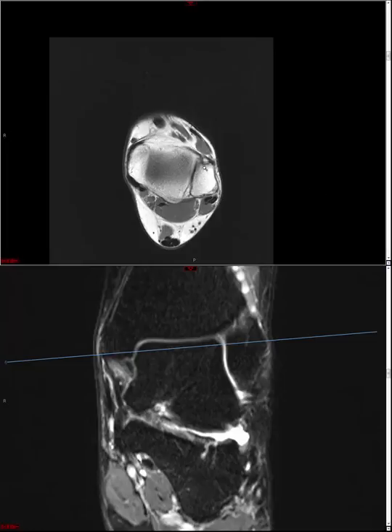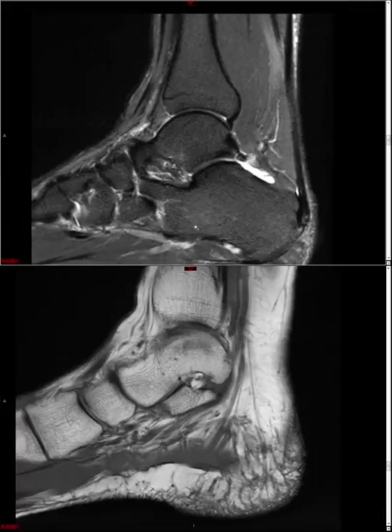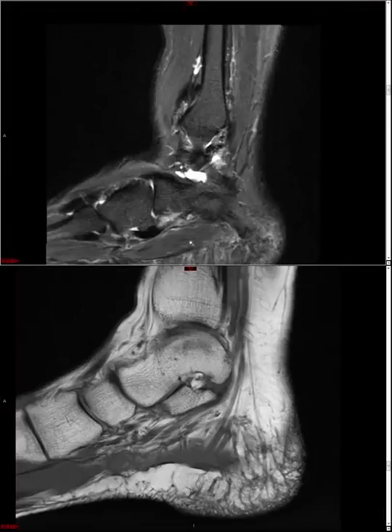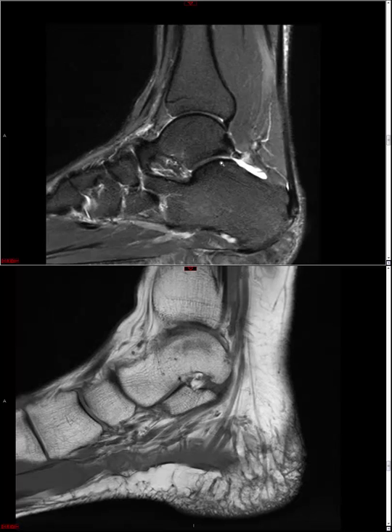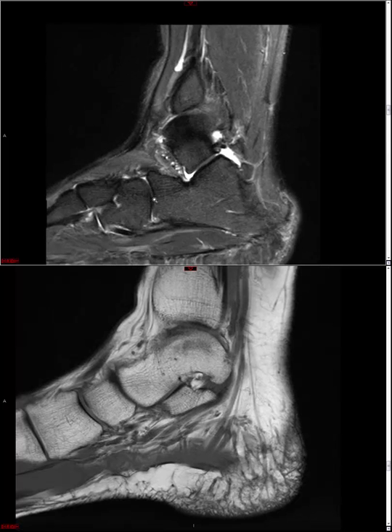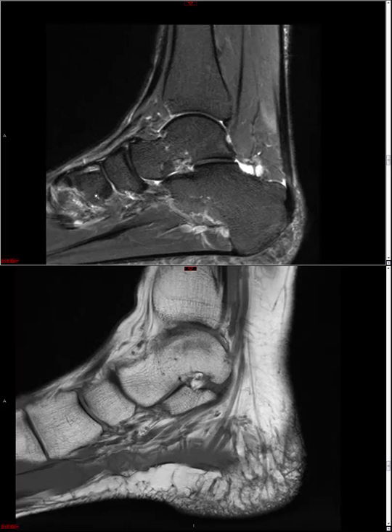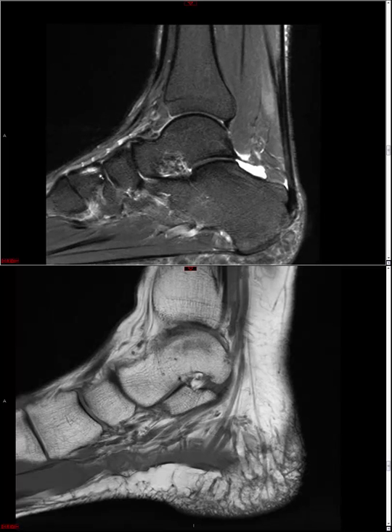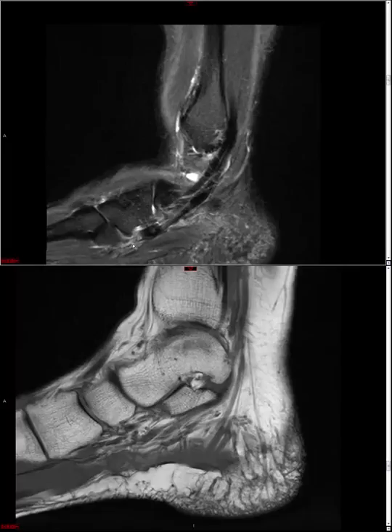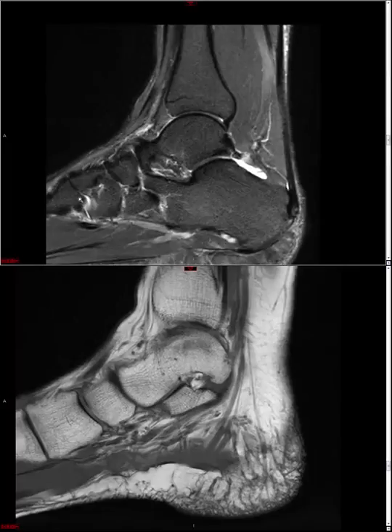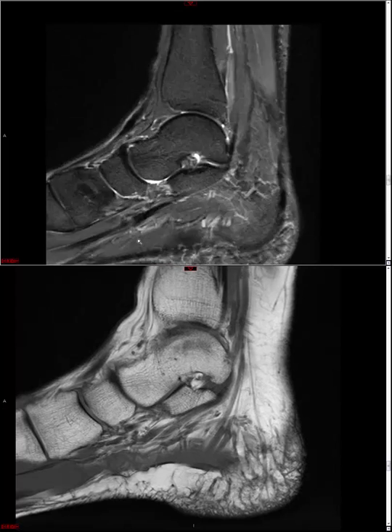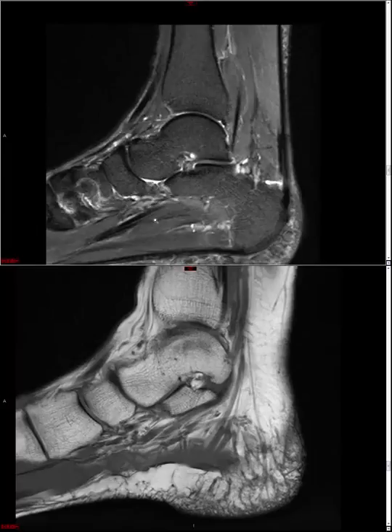We've done tendons, ligaments, talar dome, and tibiotalar joint. A very economical way to get through the remainder of the joints is to pull up the sagittals, because those images cut through the main hindfoot and midfoot articulations in cross-section. In one fell swoop, you get a look at the posterior subtalar joint, the transverse tarsal joints, calcaneal cuboid joint, talonavicular joint, navicular cuneiform joints, and the tarsal metatarsal joints. Just a couple of scrolls back and forth and you can assess all the midfoot articulations quite easily.